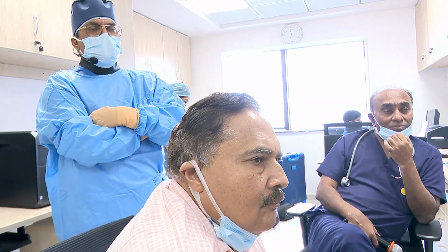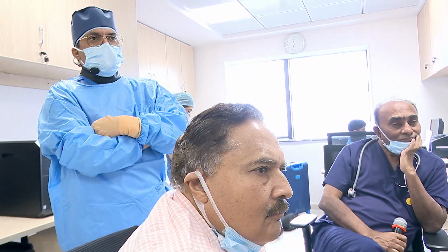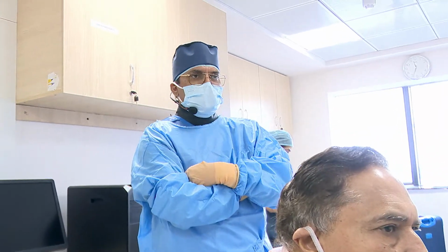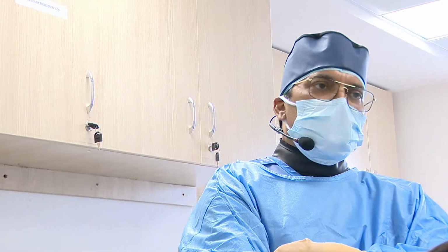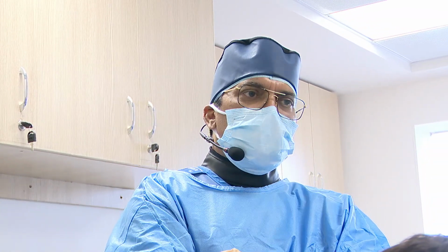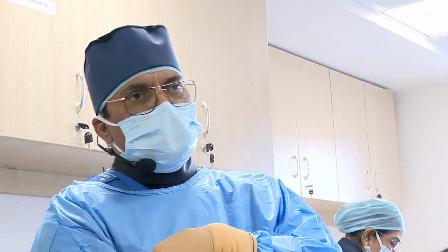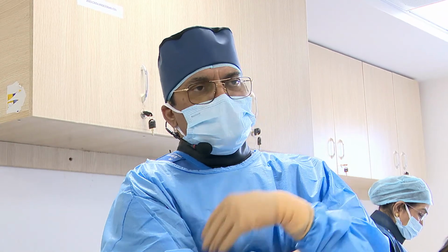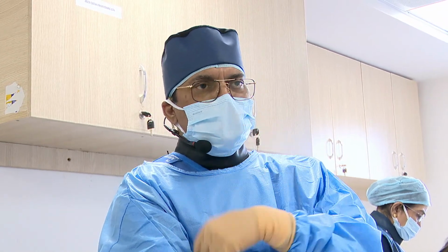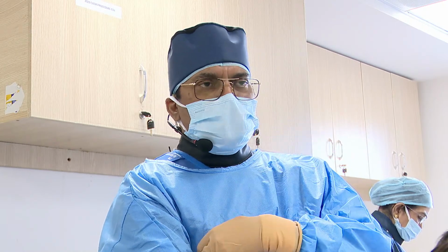In this case, initially we will acquire the OCT imaging. Today we will try to use the new version of the OCT catheter, the OCT OPSTAR. The advantage is it is more trackable, more flexible. You can reach the distal lesion, you can go through tortuous lesions, and there are salient features of that particular catheter. The new version has 3 layers, where penetration capacity is more. Its shaft is more rugged, more flexible.